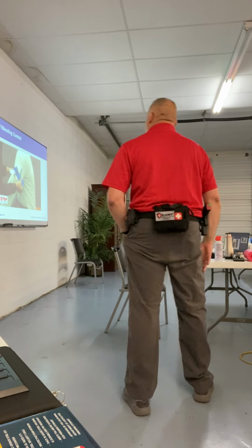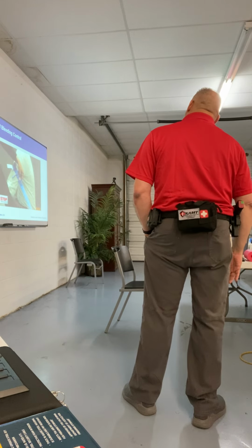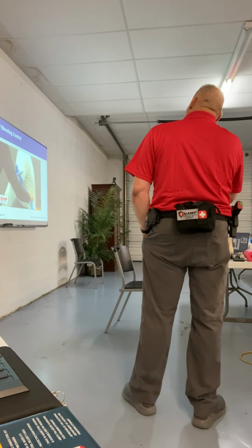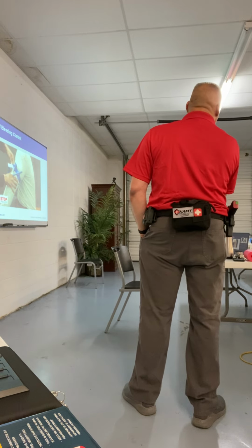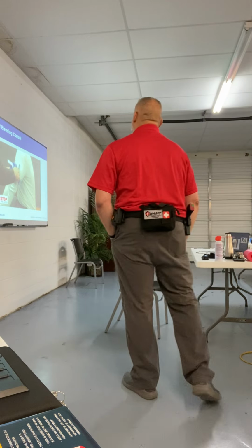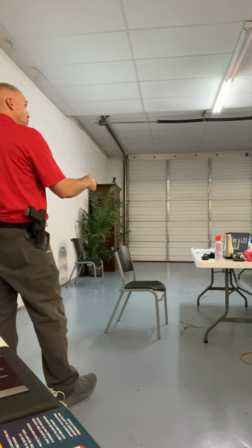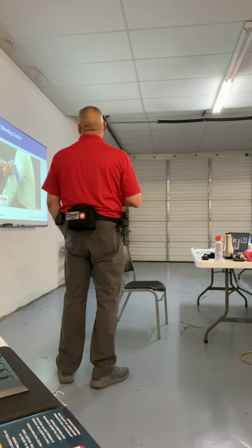Let's see if they know what they're doing by putting the tourniquet on. You know what, it's slower though. You're being very deliberate, huh? Yes. Why is that this thorough? How does this differ from the way we put ours on and putting it on yourself? If you're putting it on someone else, you put it on the orientation that works for you. Yeah, the same. That's good and hurting there. Ooh. Yep, that's tight.